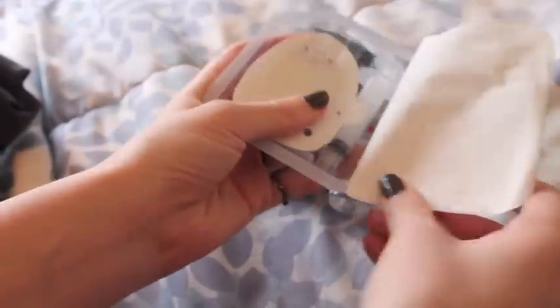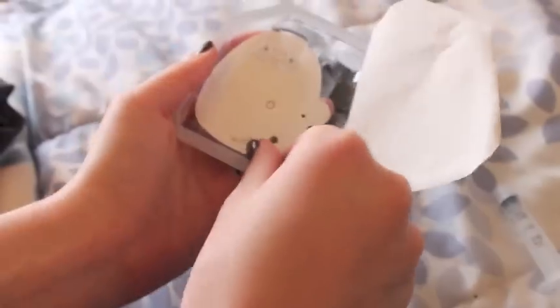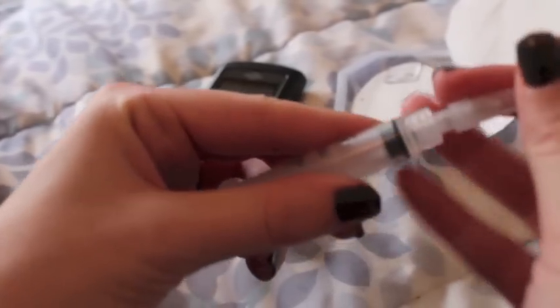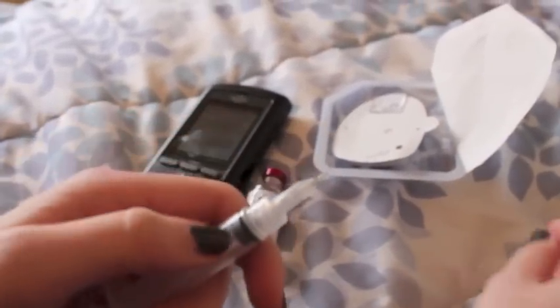Next, you're going to open this up, and inside you're going to pull out the syringe and the needle. You attach it just like this. Pull it off like that.